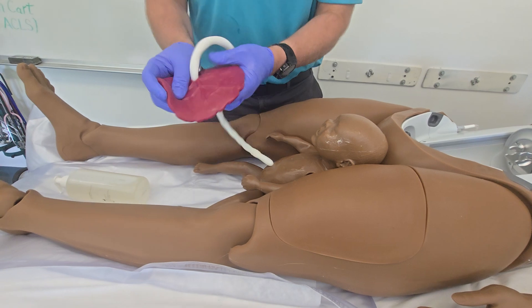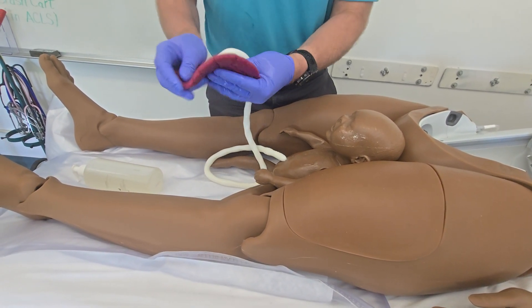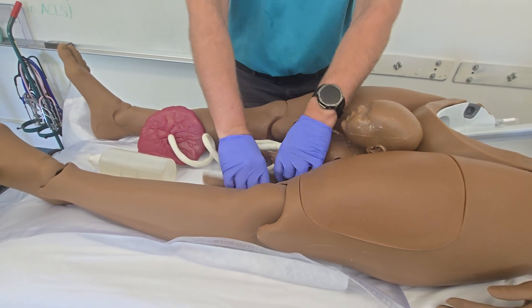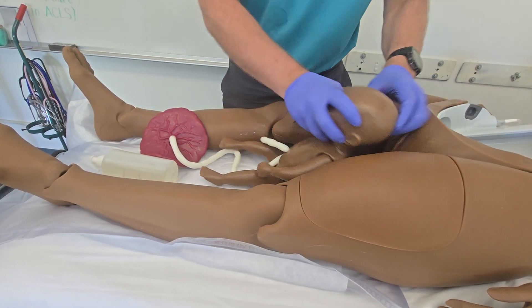Lubricate the placenta itself as well. You still want to use a decent amount, but you shouldn't have to reapply nearly as much as you did with the Simmom solution.